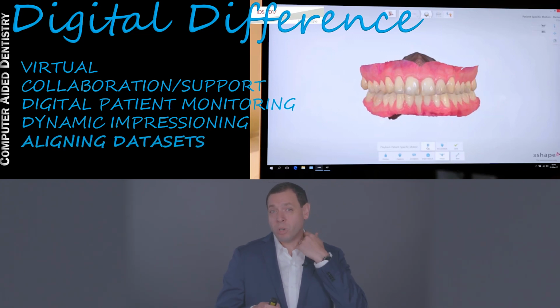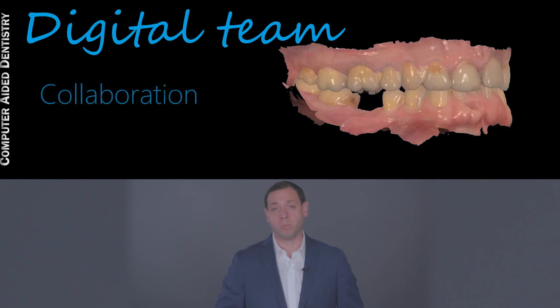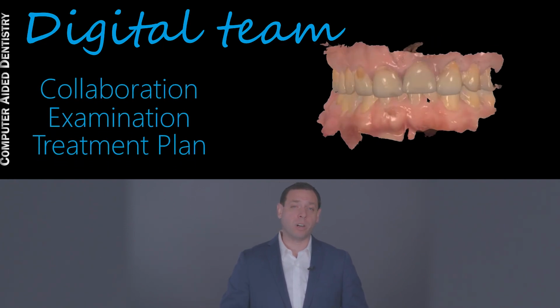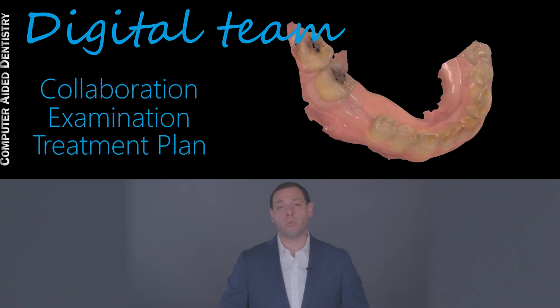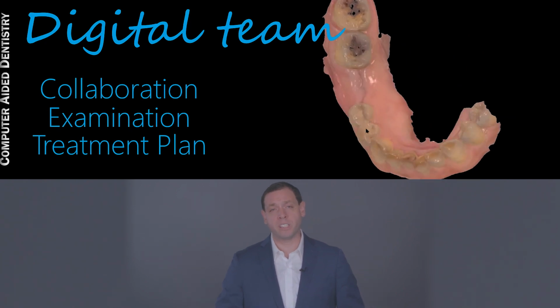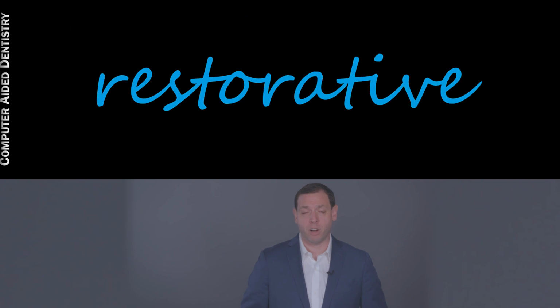But fundamentally, the real tools of digital dentistry allow us to align data sets. Digital alignment, that's the true power of digital dentistry, and that's what we want to leverage with our ecosystems. So a case like this, where we have a patient who's coming in for an implant plan, and we're going to sit down and analyze part of the surgical team, part of the restorative team, the complexity of the case, we have a lot of information readily available to us to collaborate in real time, whether we're in the same place, and to use that information to develop a very specific treatment plan for our patient.